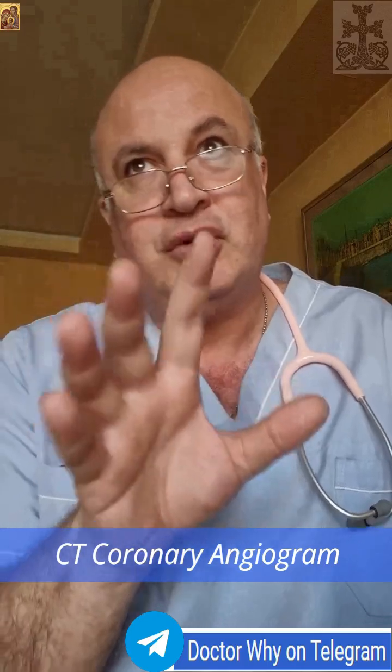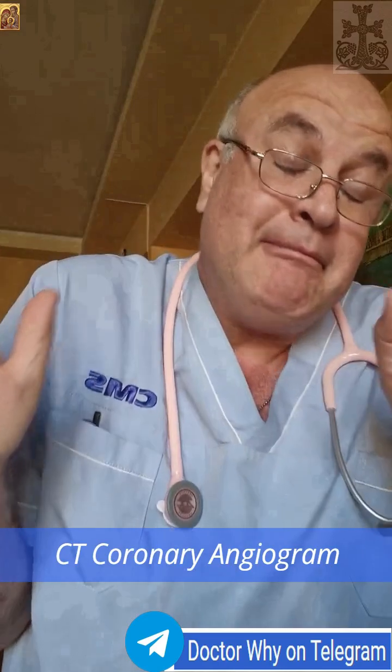So CTCA, actually, I repeat, I'm not absolutely sure, can we trust it or not? But there are some real interesting articles that say that yes, we can detect unstable plaques, vulnerable plaques that provoke myocardial infarction. Maybe, by the grace of Jesus Christ, it could be like this? Because with classic coronary angiography, all that we can see are stable big plaques that provoke problems.